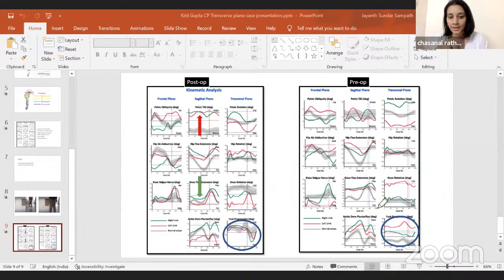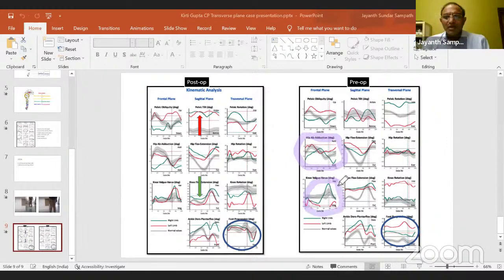And particularly in the graph, in the knee varus valgus, which Taral sir also pointed out, it was quite more obvious. So when the graph also shows a lot of such things, I think the gracilis is probably more of a culprit rather than the other two. So you're looking at this, the hip adduction? The lower one, sir, the knee valgus. This one. Yes. But you can see that in post-op, we've got our marker placement better. I did release a gracilis. So you could have left the semitendinosus and semimembranosus, just the gracilis. So probably the tilt would have been better.